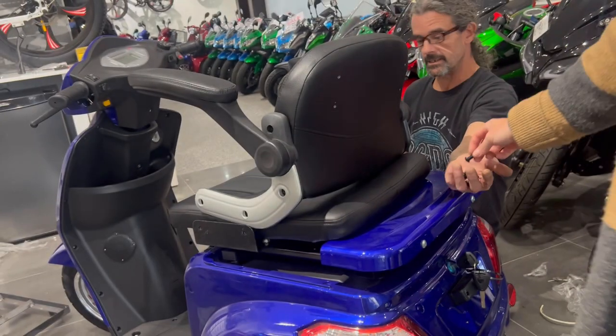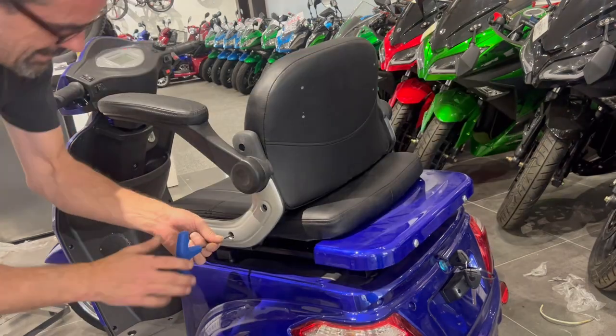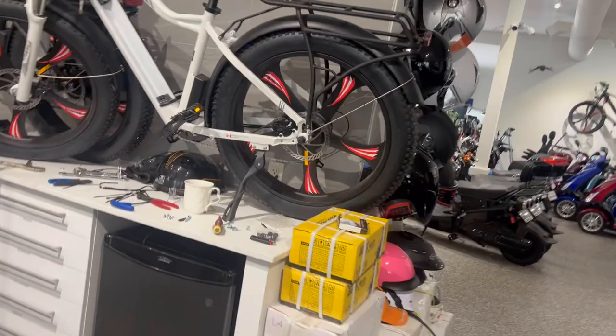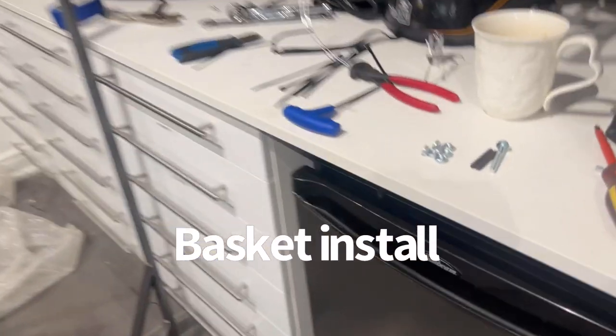Those are the bolts for the seats — 5mm allen key. So you need a 6mm and a 5mm. It's literally just putting on four screws on each side.